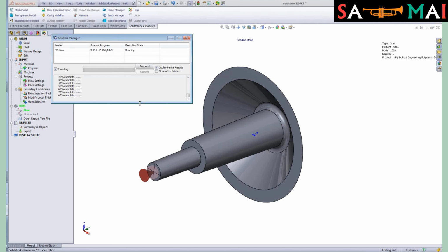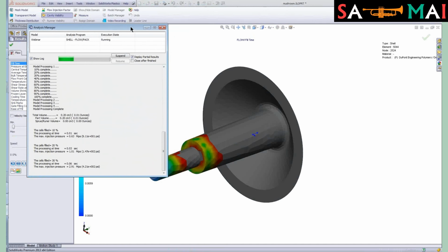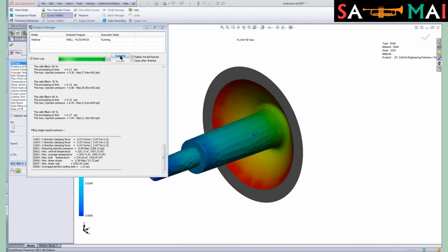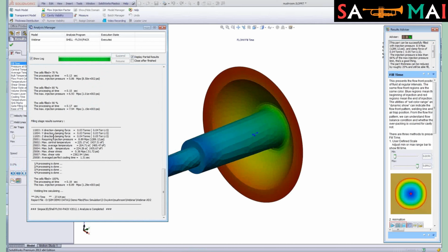I'm going to move these settings around a little bit so you can see what happens on screen. And you'll notice that as this model is running, we're going to see in real time what's happening to the flow of plastic in our part. Now this is really nice. If I happen to look as the plastic is flowing into the component and I see an issue in the design, I could suspend the run, go in, modify whatever the parameters are, and then fix that. So here what we'll see is once the fill of this component is finished, I get the output that I would need to tell the injection mold maker, basically clamp tonnage, the maximum injection pressure, things that they're going to be interested in for processing the component.